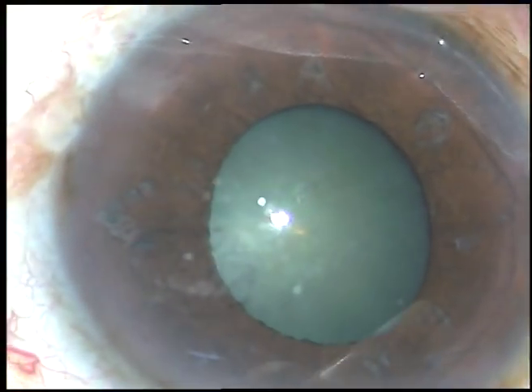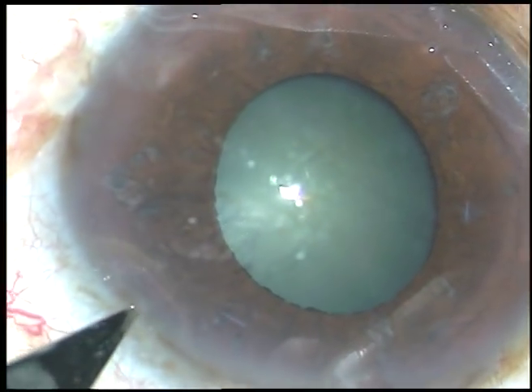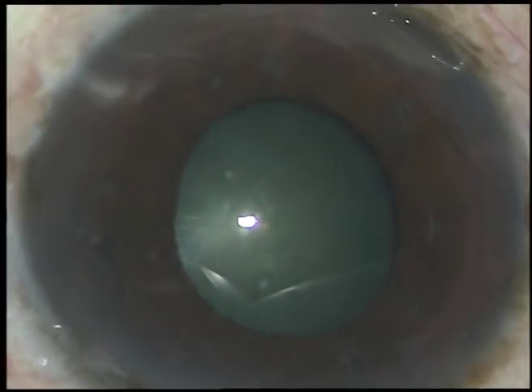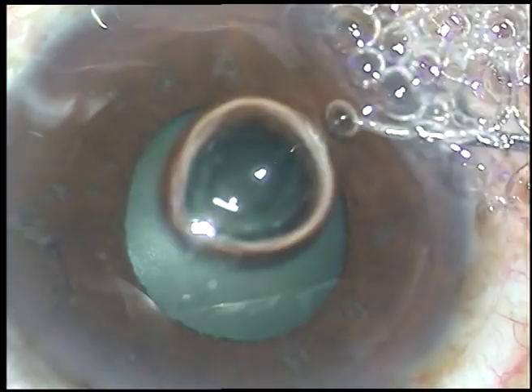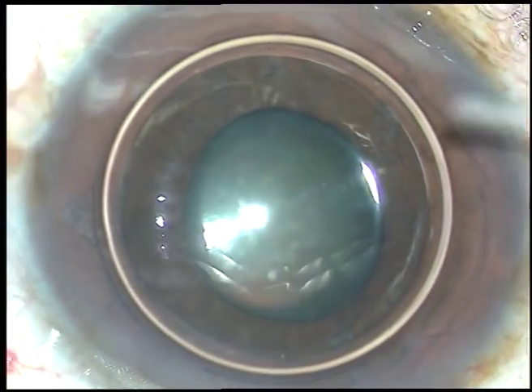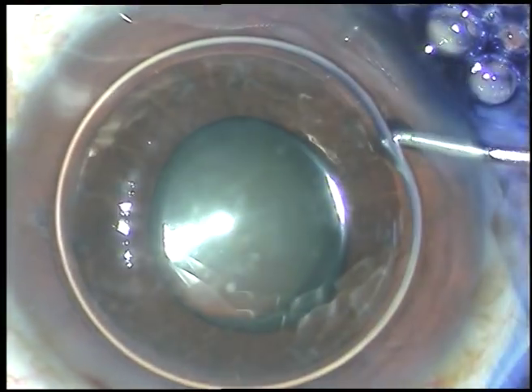By this time the incisions have been made and now I am going to stain the anterior capsule of the cataractous lens with trypan blue dye underneath this air bubble. And here goes the trypan blue dye.